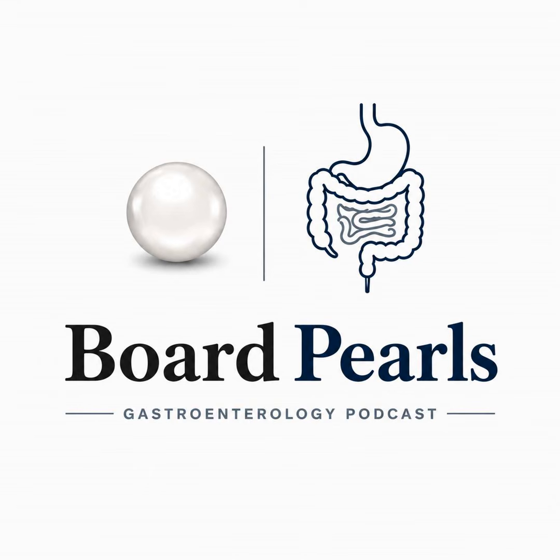A plastic stent, by contrast, gives only about 3 months and needs repeat ERCP to swap every exchange, delaying surgery and adding risk. So fully covered metal is the durable choice here precisely because the covered design defeats ingrowth.